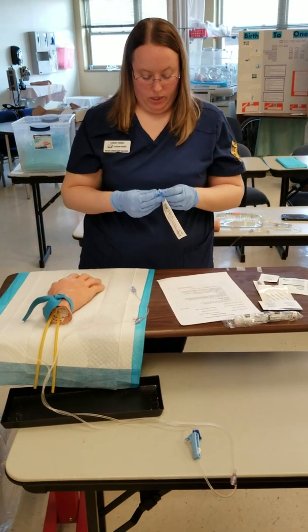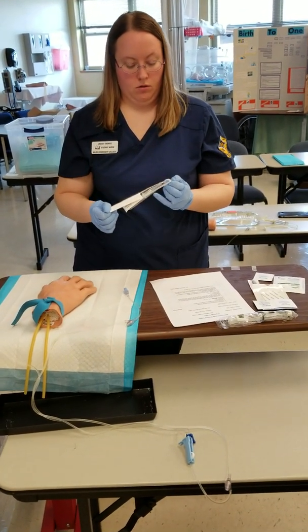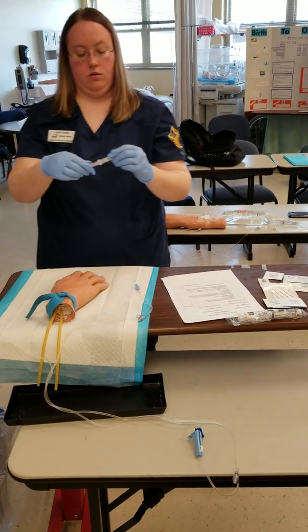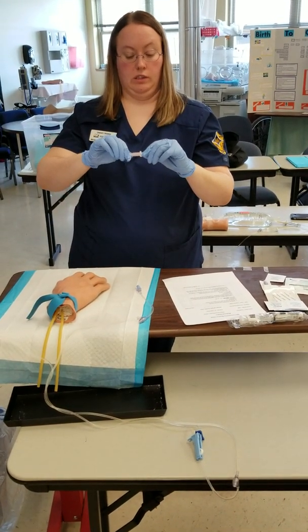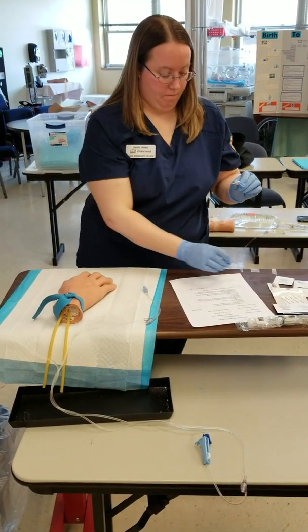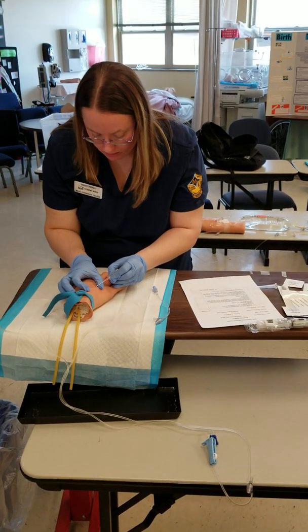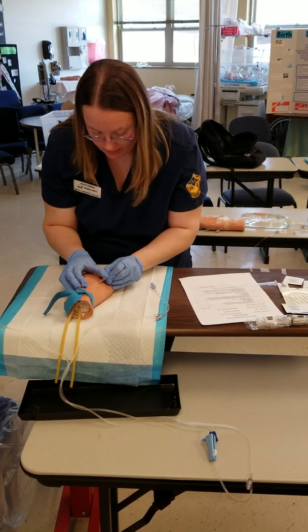Get my catheter ready. Cap off. Make sure the bevel is up. Insert the needle. Hook. Advance the catheter.